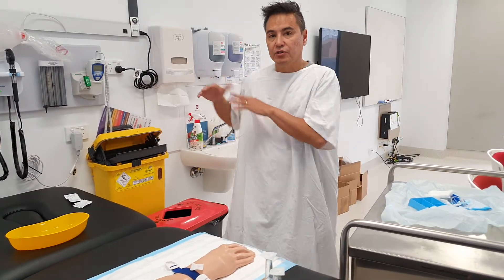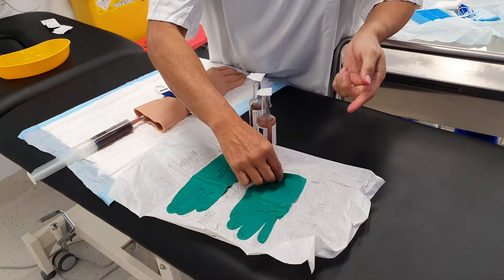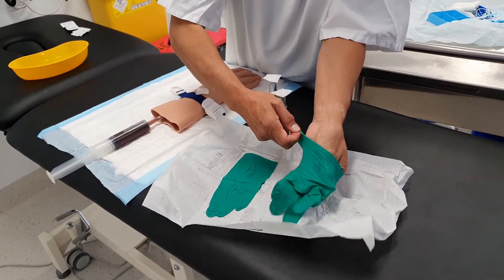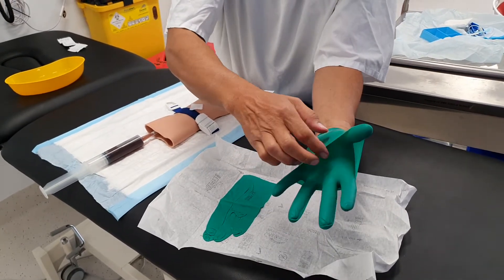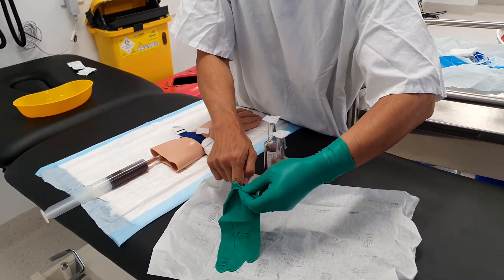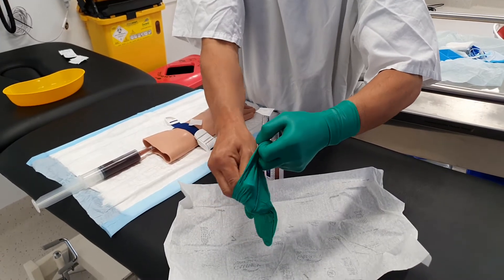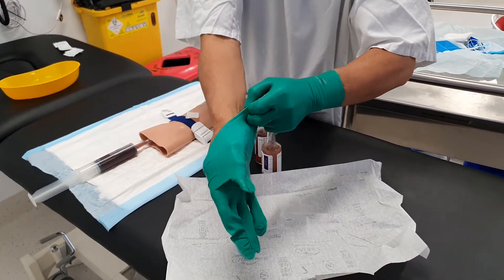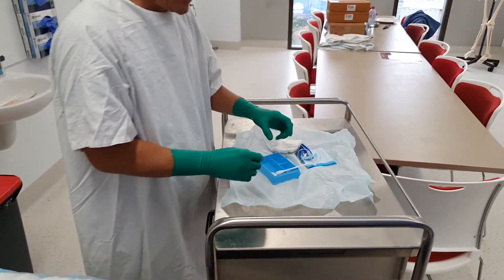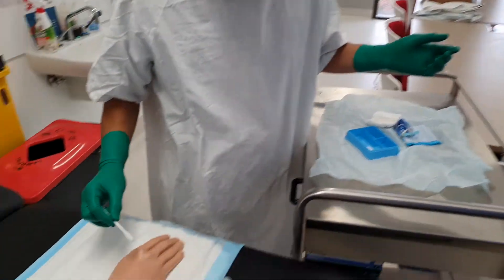I'll now go off and simulate my three-minute hand wash, then come back. Having a look making sure that you don't contaminate the gloves — this is the tricky one, the second glove. Make sure that my bare skin doesn't touch the outside of the glove, then start the procedure.